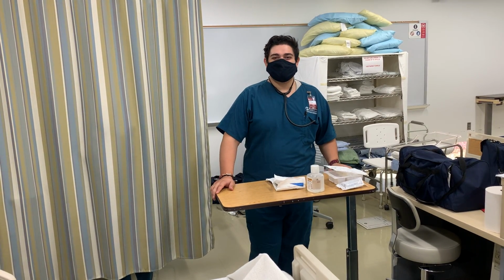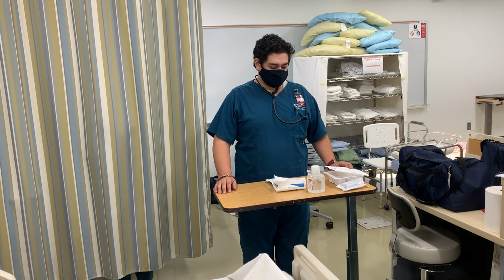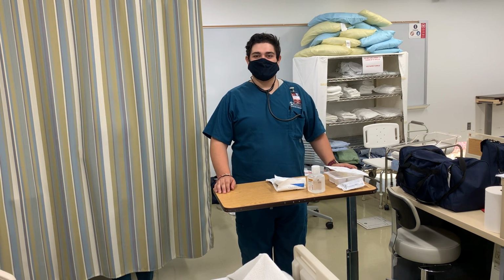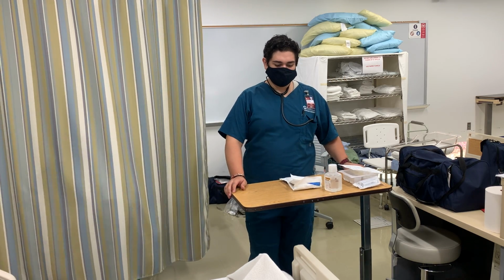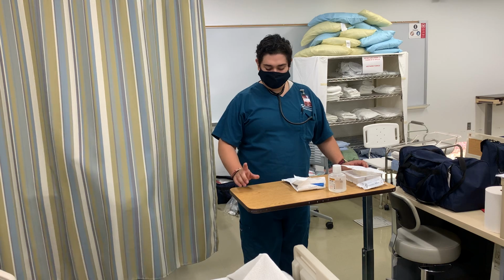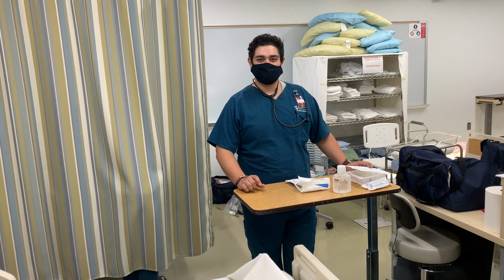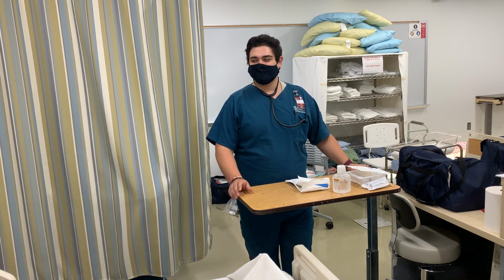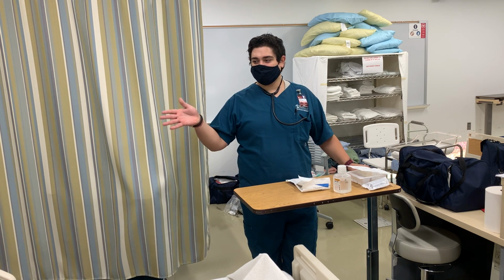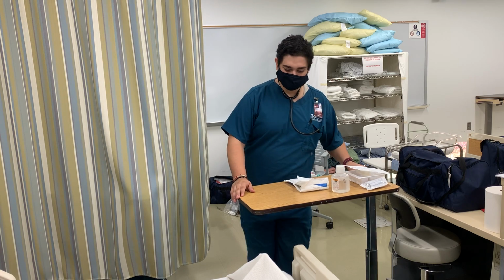My name is Hector, and I will be performing my skills tracheal care and suctioning. Before I enter Mr. Doe's room, I will be assessing the physician's orders and determine when was the last time he had the care, reassess the time. So it is due. So I will make sure that I have the right patient's room before I enter.